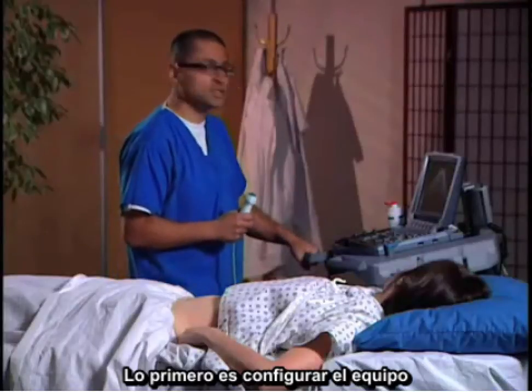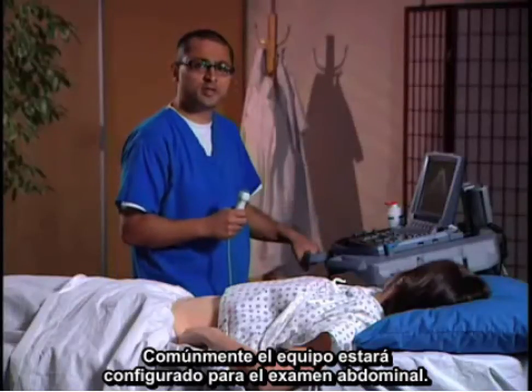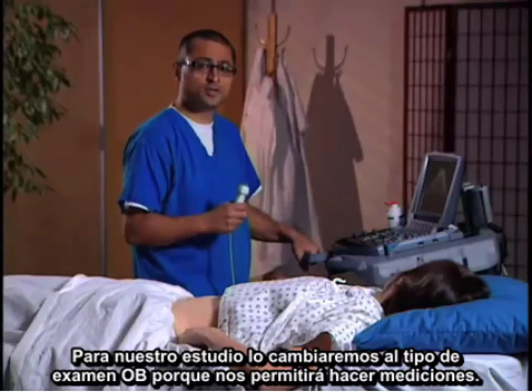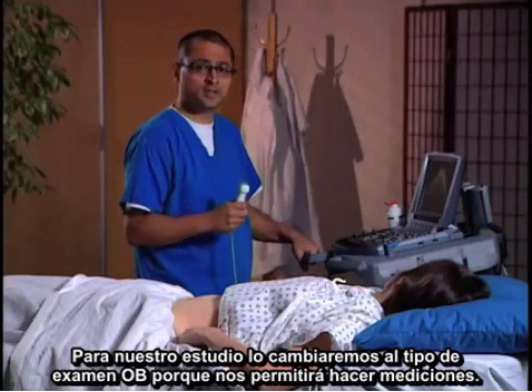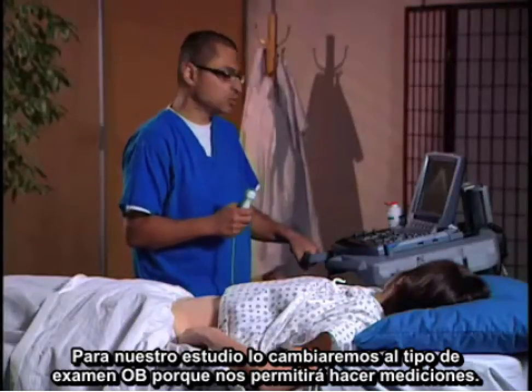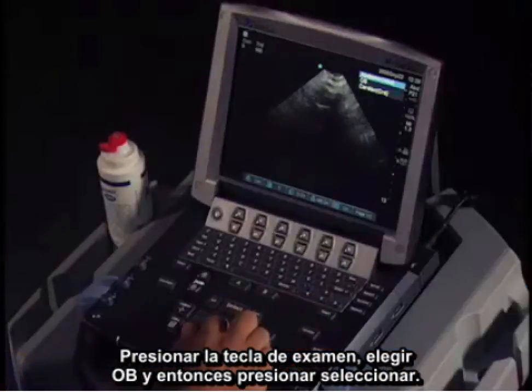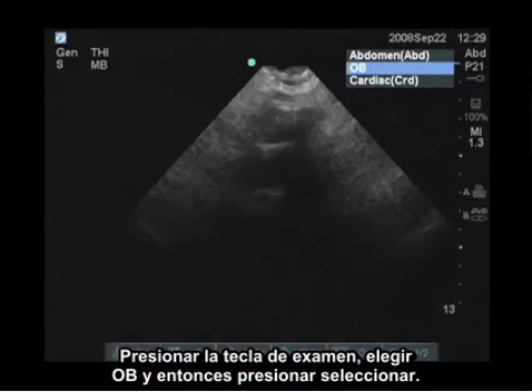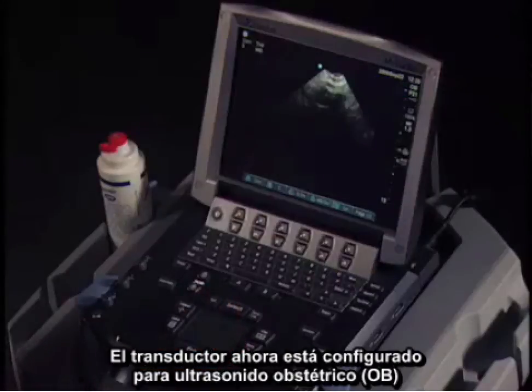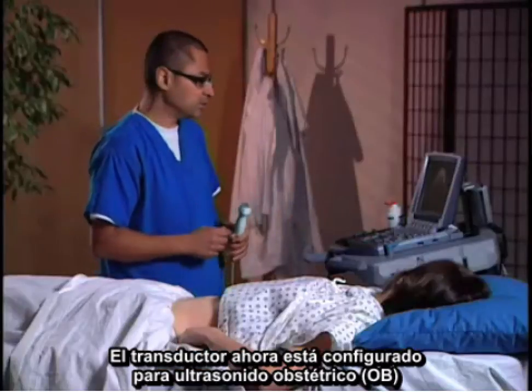First thing is machine setup. Commonly, the machine may have already been set up in an abdominal configuration. I'm going to switch to the OB configuration because it allows us to do measurements as well. I'm going to hit the exam key, click on OB, and then hit select. The transducer is now configured for OB ultrasound.